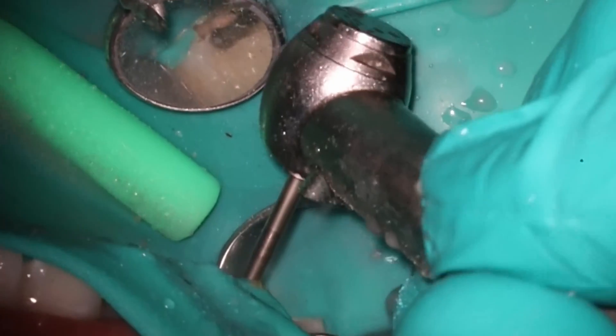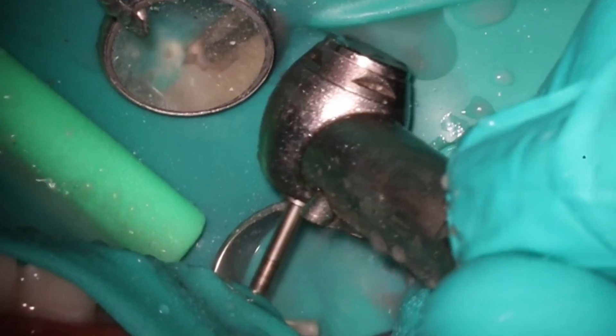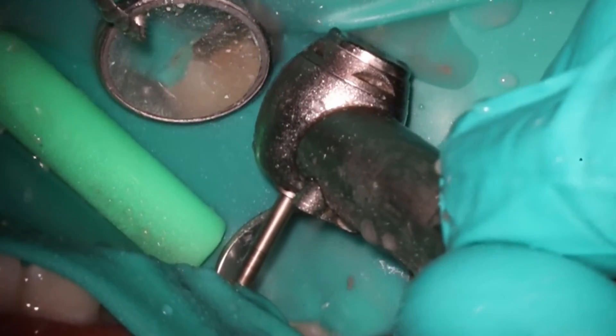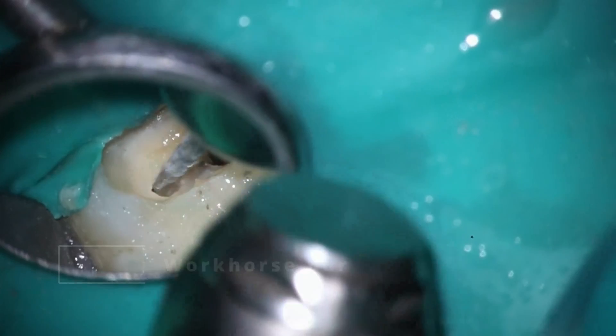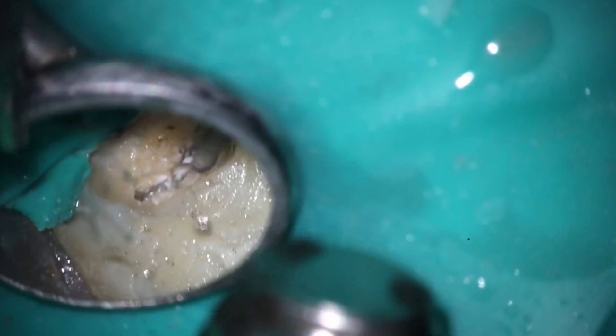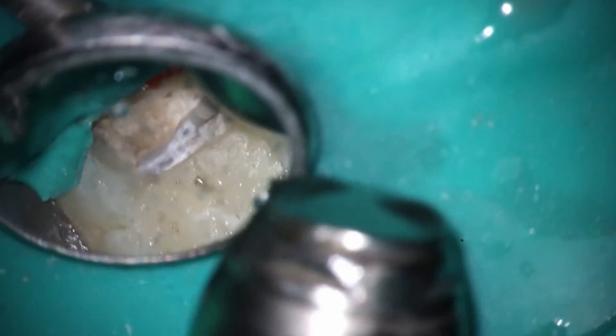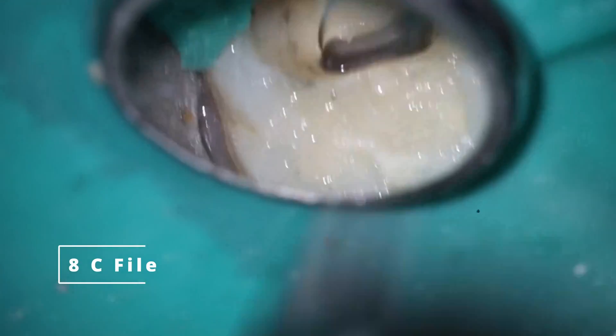This is not something I usually use for access, but it's a fantastic bur for removing caries. I don't really like the slow speed that much — I feel I actually have better tactile sensation with the high speed — but if you want to use it with slow speed, go for it. So now we have the access with a little bit of dentin still inside there, so I'm going to connect those two holes that have been exposed using my workhorse bur, and we're going to get a fair amount of use out of this bur today.